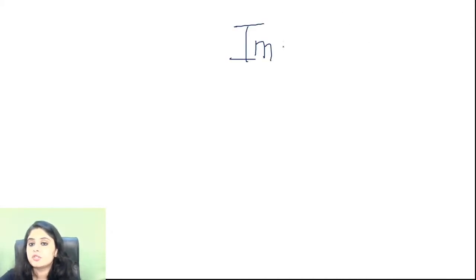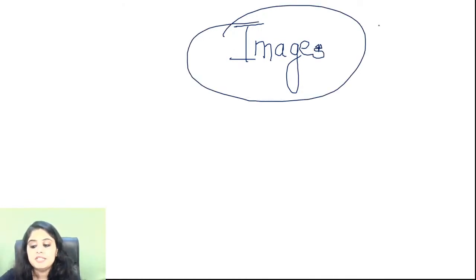So yes, with that, our basic images, yes, I would still call it very basic because I have not discussed theory. We've only gone in for the images because that is what this session is all about. So I give you probably a week's time to read through Robbins or whichever book you are going through, and to revise these images.